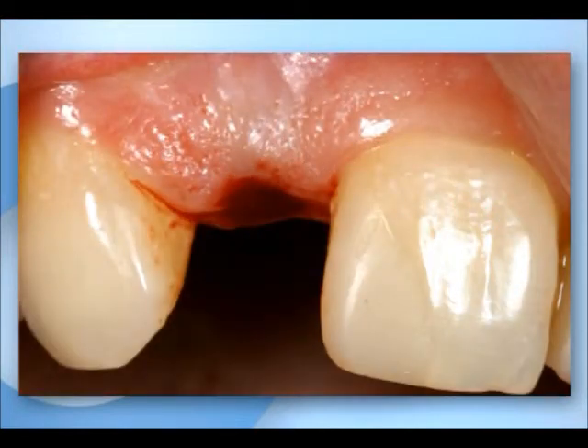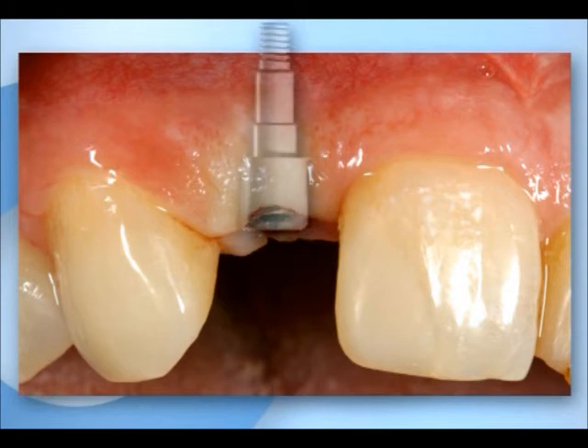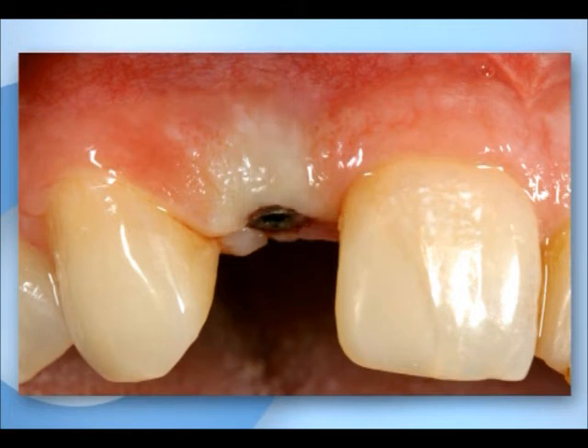How skillfully the implant is uncovered is important for the aesthetic success. A minimally invasive technique is used to reduce the trauma to the soft tissues during gingivectomy. The short cylindrical 2mm gingival former is replaced by a longer 4mm one of identical shape to predefine the emergence profile.